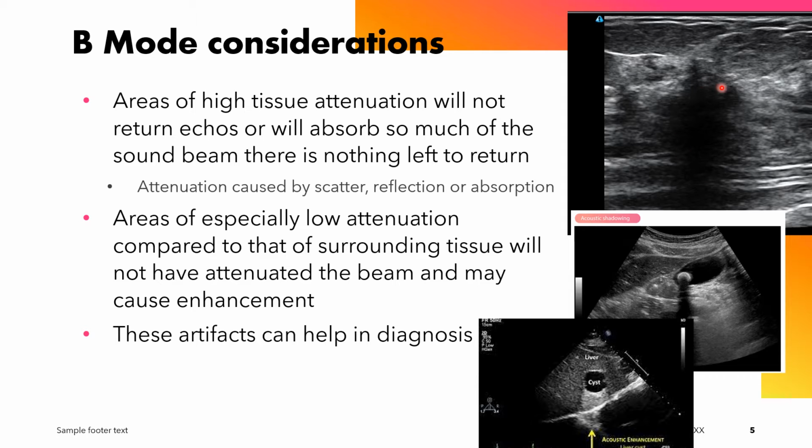So this is an example of a likely breast mass, and it doesn't have a huge reflection. So we know if we're losing all of our sound wave in the far field, then it must be either scattering or absorbing this. And in this case, because we don't see a lot of scatter coming into other regions of the transducer, this must be absorbing it. And malignancies have the more common feature that they will be highly absorbent and will sometimes create shadowing. So this would be a concerning sign, that posterior shadowing in a breast exam.